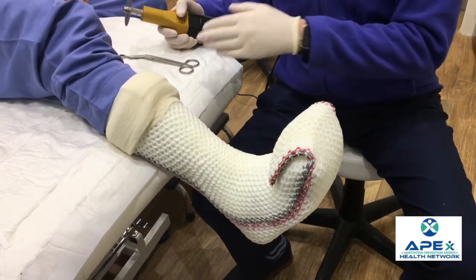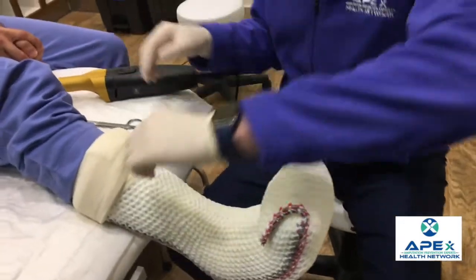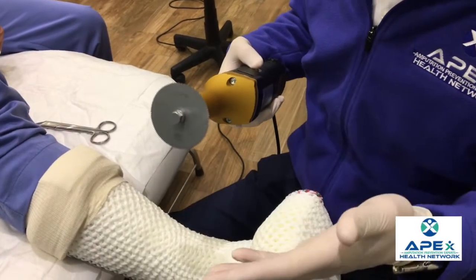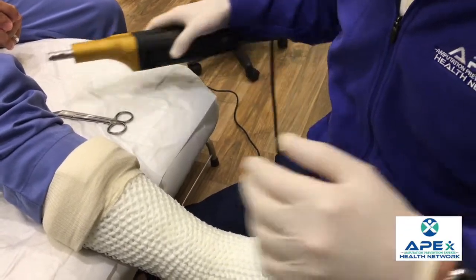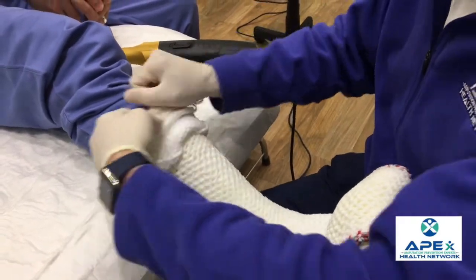That's where you want to cut when using the cast saw. The cast saw vibrates — it doesn't go circular. Because it vibrates and is not going in a circular motion, it's not going to cut the patient's skin, but it can get hot as it goes through the cast and burn the patient's skin. So we still want to be careful and use the padding as a guide.